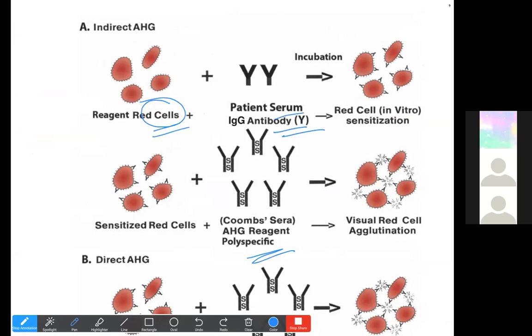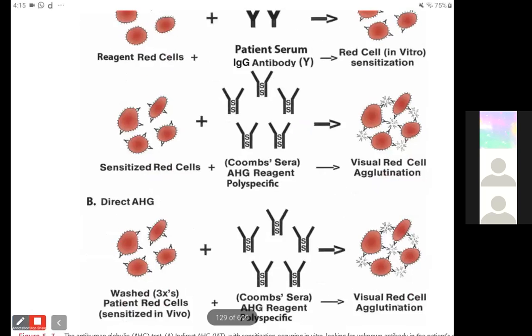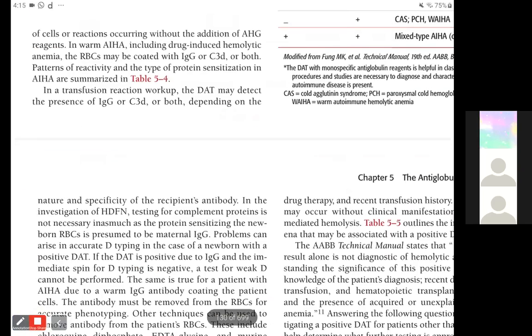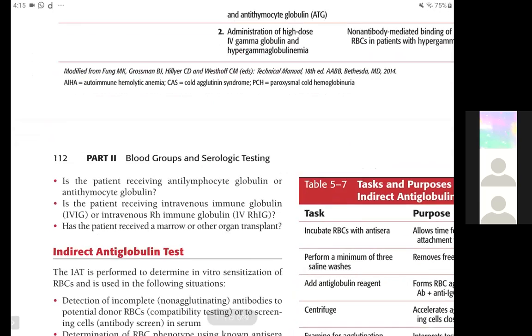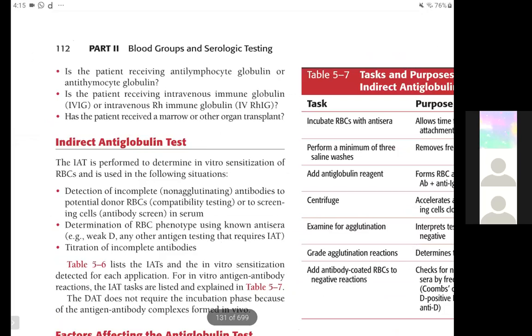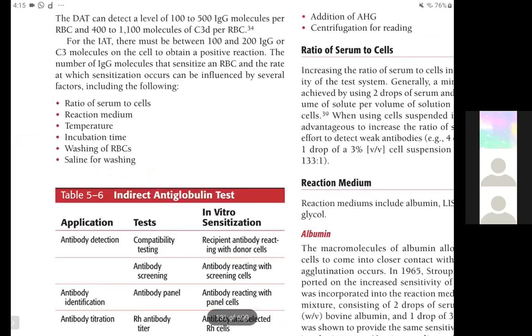And there can be patient problems and analytical problems in the sera, that is how it is collected: if it's collected from IV lines, in EDTA tubes, or in gel tubes, if there is bacterial contamination in the sera, and also if it is stored for too long, or refrigerated and then used in the mixture, even that can cause problems.